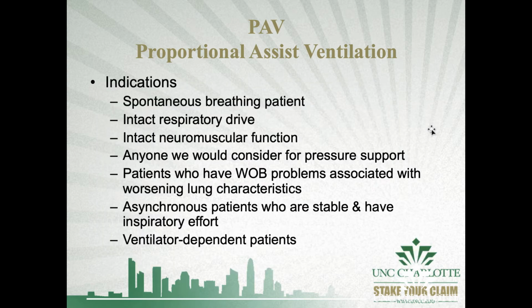So essentially it's used for a weaning mechanism, something to make people with air hunger and constant dyspnea a little bit more comfortable on the ventilator, so people with COPD. But these patients have to have an intact respiratory drive, and basically any criteria for them to be on pressure support, they probably could use this mode.